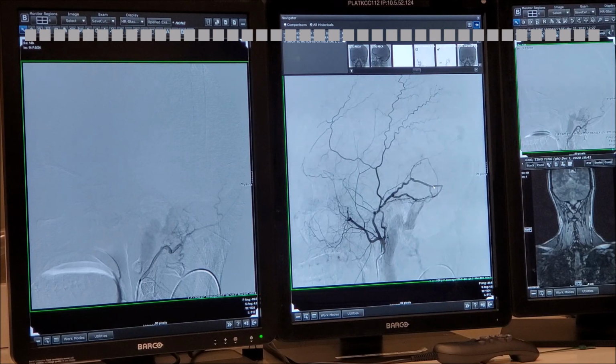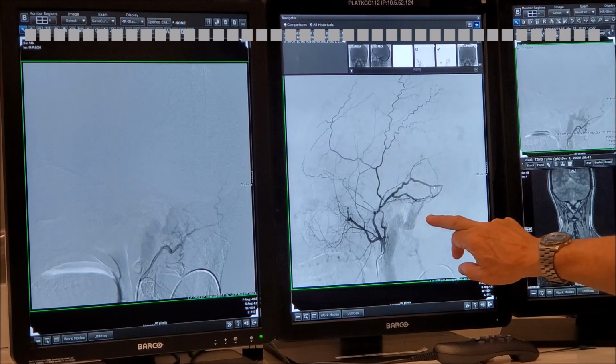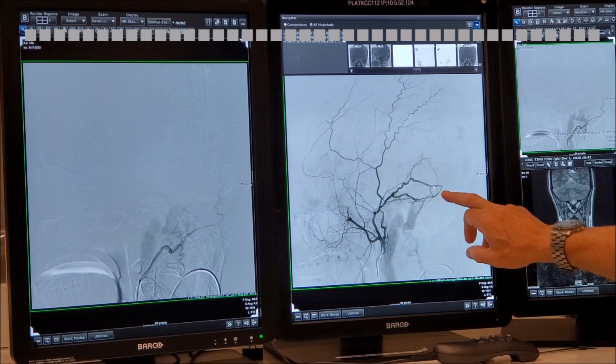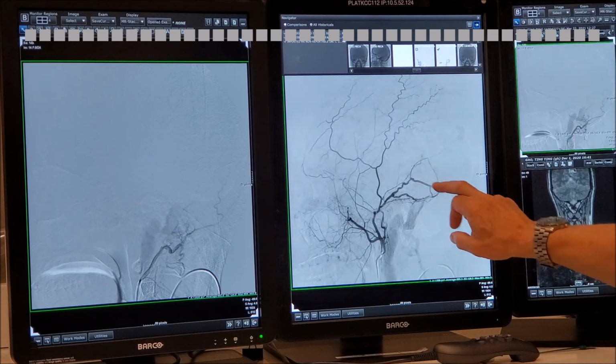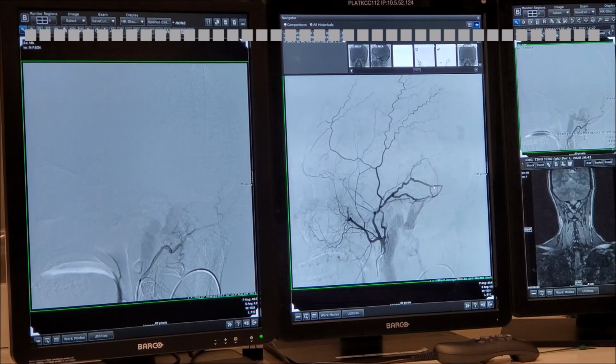I would imagine that... Don't imagine. This is not science fiction. Come on. There is a little balloon in the tip. Scepter. Why is the Scepter the best? It gives you flow control. It gives you everything. You don't have to reflux all the way to the petrosa. You have flow control. You start injecting here, it goes in there, you see a drop going into the sinus, you stop. Then the next one you inject will do this. You can actually get the whole thing sometimes through only one branch with a Scepter. So that's the best catheter to do.